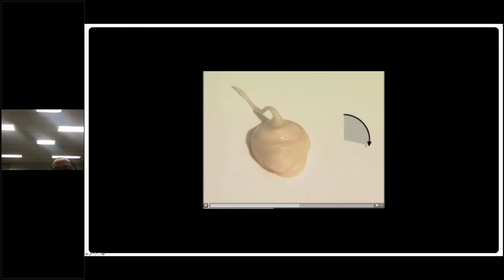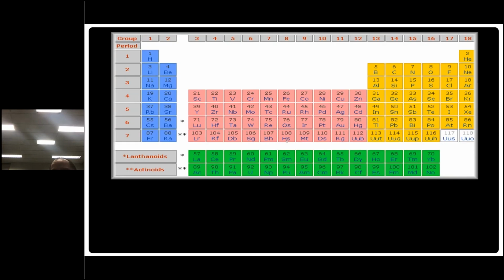As the glass ionomer cement sets, after about 40 seconds, you can see the gloss disappearing. Once that gloss has disappeared, the glass ionomer cement has lost its ability to chemically bond to the tooth. The ability to form that mountain range is only there while the glossiness of the mix is still present.